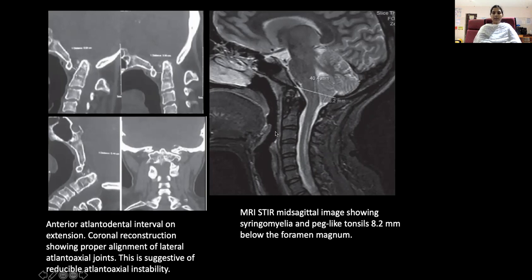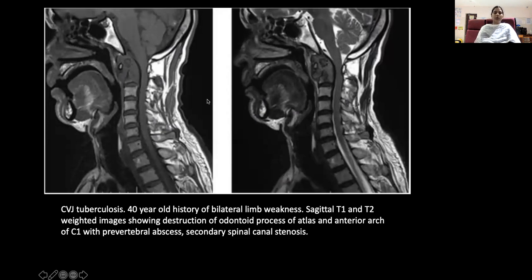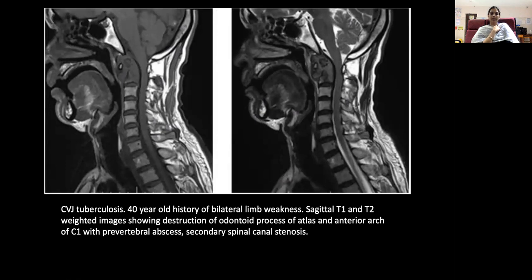This MRI STIR mid-sagittal image shows syringomyelia and a peg-like tonsil which lies below the foramen magnum, suggestive of Chiari malformation. This is a craniovertebral junction tuberculosis case — a 40-year-old with history of bilateral limb weakness. Sagittal T1 and T2 weighted images show destruction of the odontoid process with anterior C1 involvement, a pre-vertebral abscess, and secondary spinal canal stenosis.